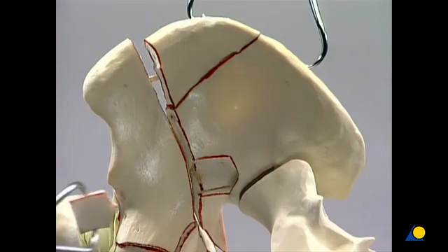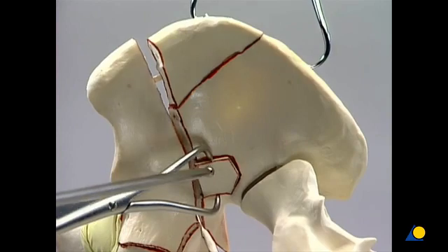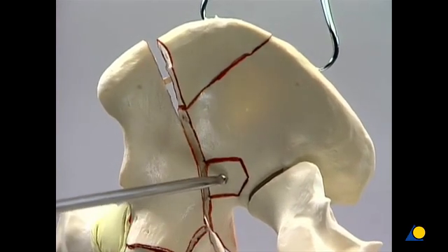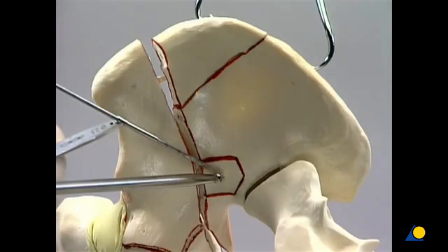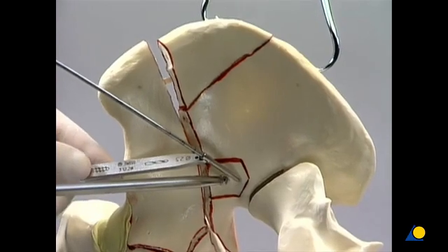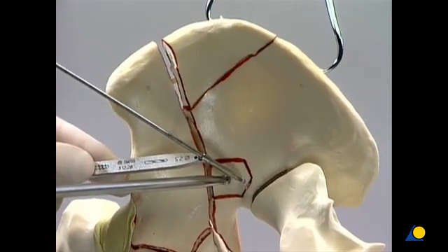The small free fragment of the inner posterior aspect of the pelvis is repositioned. The ball spike is used to exert pressure, and a lag screw is inserted. Even though this fragment is non-articular, anatomical reduction is mandatory to ensure the overall alignment of the fragments.